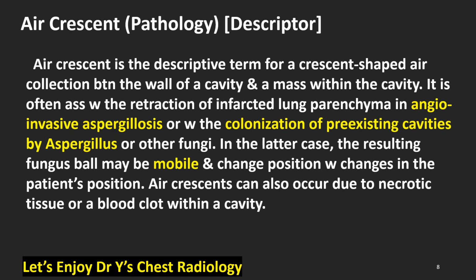Air crescent, pathology, descriptor. Air crescent is the descriptive term for a crescent-shaped air collection between the wall of a cavity and a mass within the cavity. It is often associated with the retraction of infarcted lung parenchyma in angio-invasive aspergillosis or with the colonization of pre-existing cavities by aspergillus or other fungi. In the latter case, the resulting fungus ball may be mobile and change position with changes in the patient's position. Air crescents can also occur due to necrotic tissue or a blood clot within a cavity.